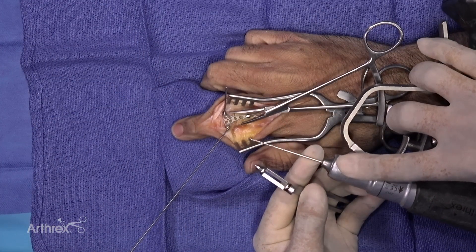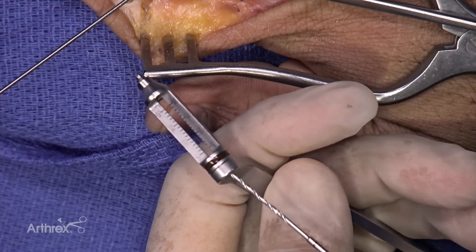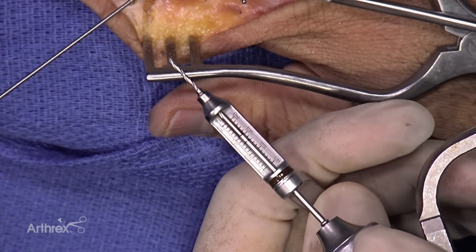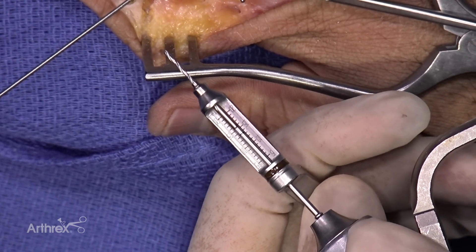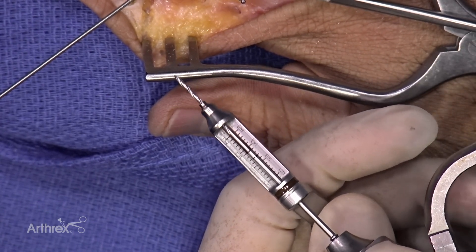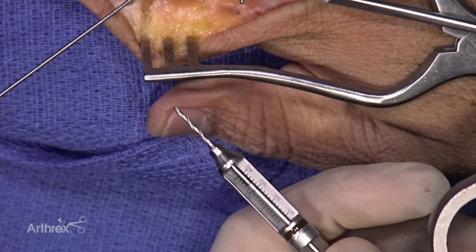This is the 1.1 millimeter drill. There's a nice black laser line on it that corresponds and allows you to measure directly off of your drill guide, saving you a step if you'd like to measure directly here as opposed to using a separate depth gauge. Of course, if you're more comfortable using a depth gauge, there's a beautiful depth gauge in the set as well.